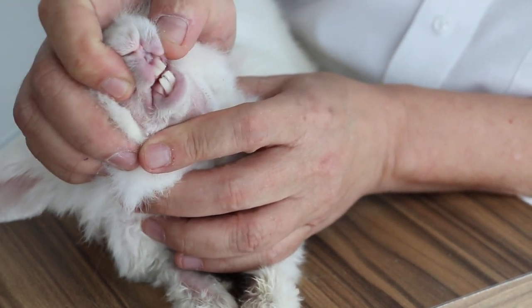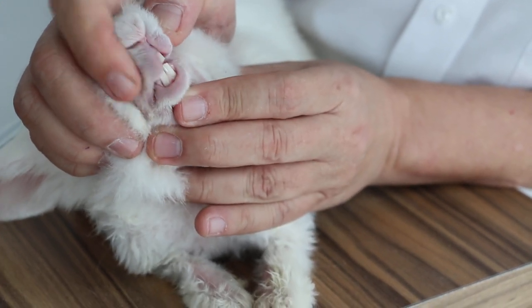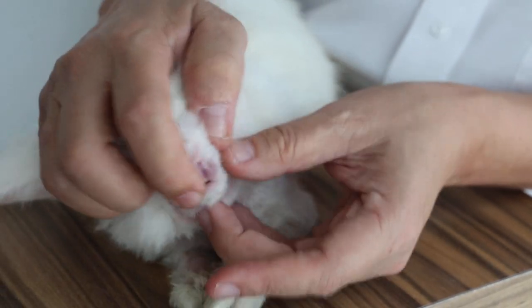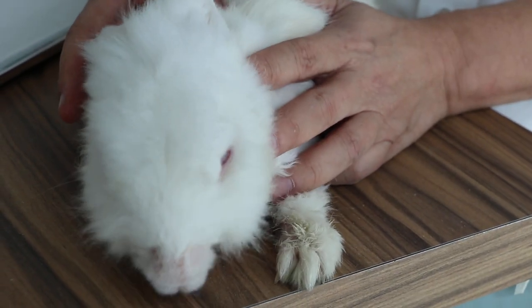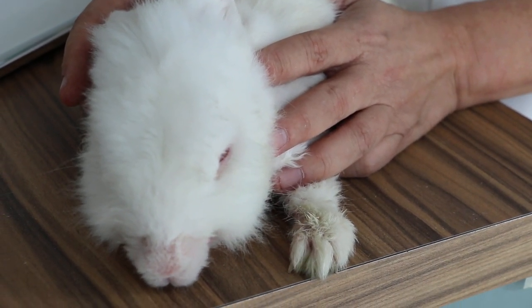Now, the teeth had been trimmed yesterday and they were quite sharp and a bit overgrown. But the main problem is not the front — the main problem is the side, the molars at the side. So I'm going to give the injection and then we will start with the sedation and check on the sharp molars first.